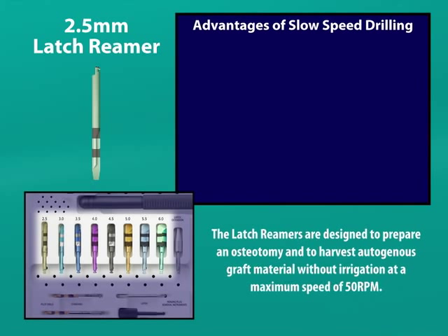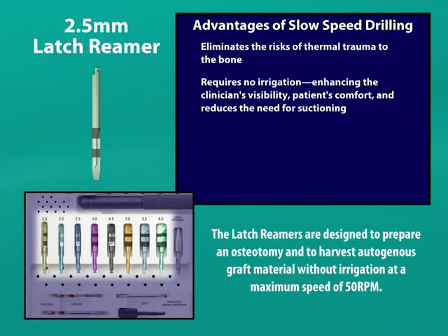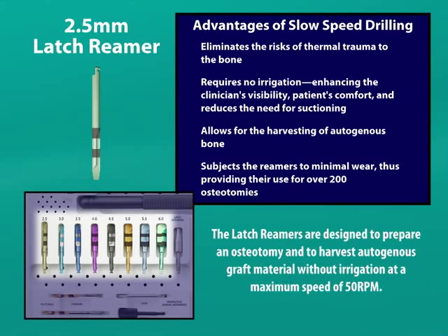The advantages of slow speed reaming are: it eliminates the risk of thermal trauma to the bone, it requires no irrigation for bone cooling — which enhances the clinician's visibility, patient's comfort, and reduces the need for suctioning — and it allows for harvesting of autogenous bone. It subjects the surgical grade titanium alloy reamers to minimal wear, thus providing their use to widen over 200 osteotomies.